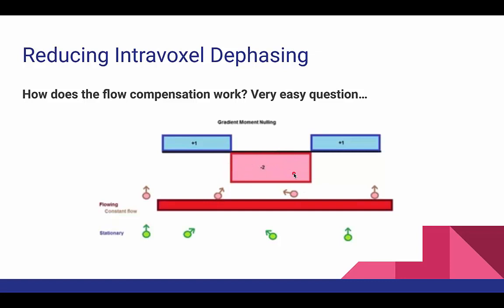You have a negative gradient, and then you will change it again back to the +1. What this does is, you can see it this way, it basically gives the rotation a good manner. It changes back and forth, and in the process we have a much more stable, stationary, well, we have a better image.